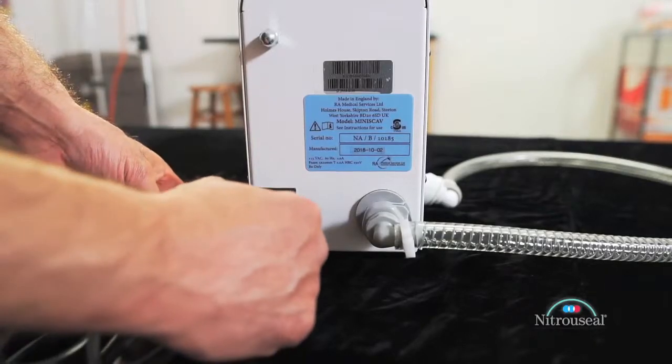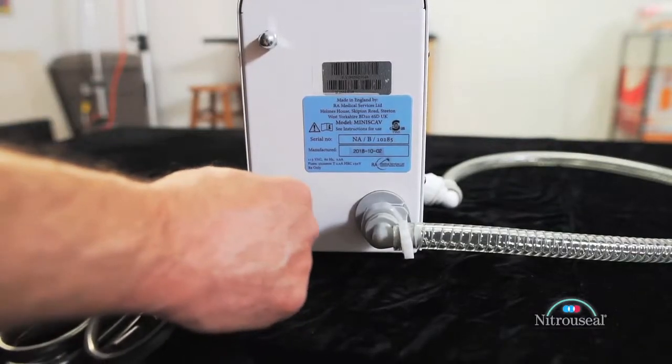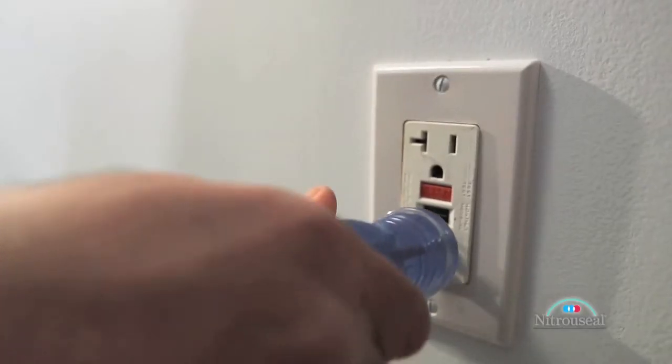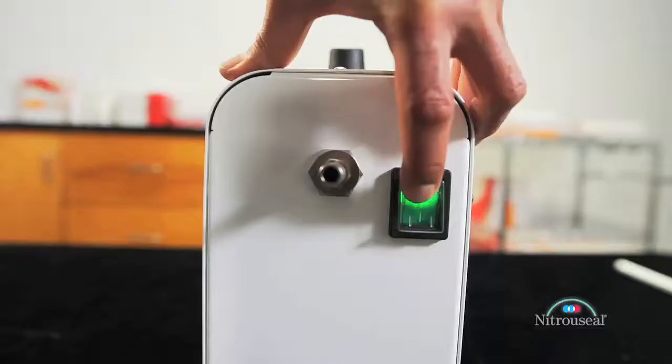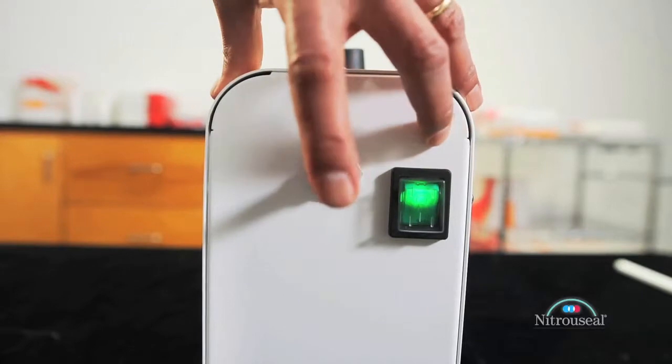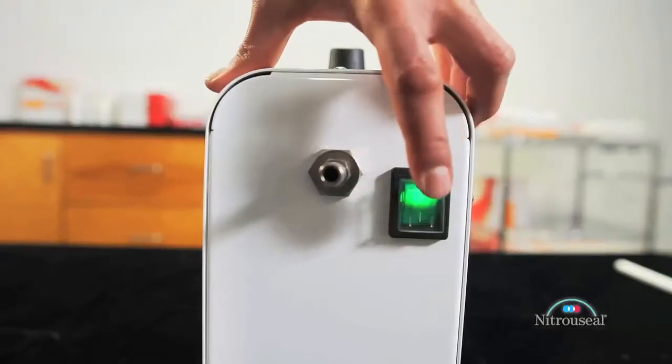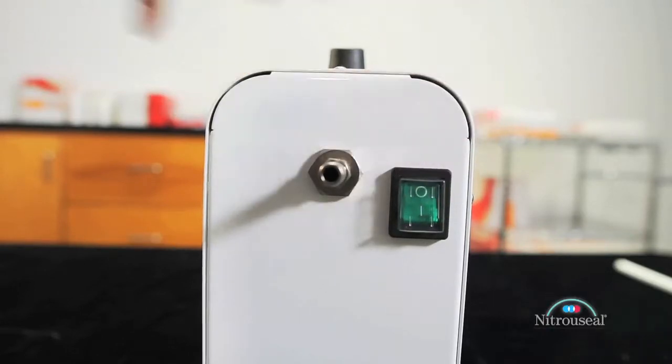Attach the electrical power cord into the rear panel of the Mini Scav. Then plug the power cord into a wall-mounted electrical receptacle. Test the Mini Scav by activating the on-off rocker switch and placing a finger over the suction nozzle. You should feel the suction. Remove your finger and listen to ensure the pump is functioning properly. Turn the power switch off.